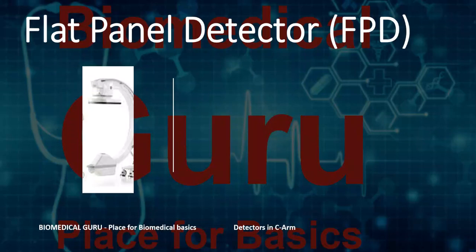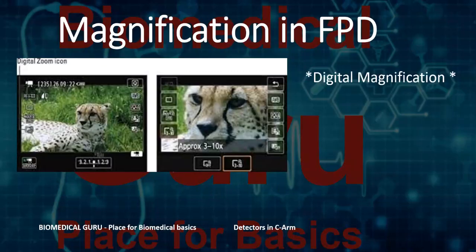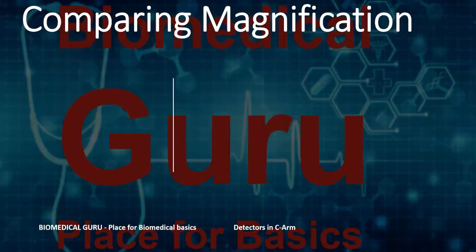Similarly, in a flat panel detector, the working principle remains the same. X-ray will come out of the tube and it will hit the detector. But here the detector is made of small micro cameras placed vertically and horizontally next to each other. In a flat panel detector, each and every pixel works as a separate camera, and the output is the total of all of these cameras together, which is sent to the imaging system. And here the magnification is a digital magnification, which means the size of the pixel won't change in magnification. Just the size of the image will be made bigger and shown to the user.